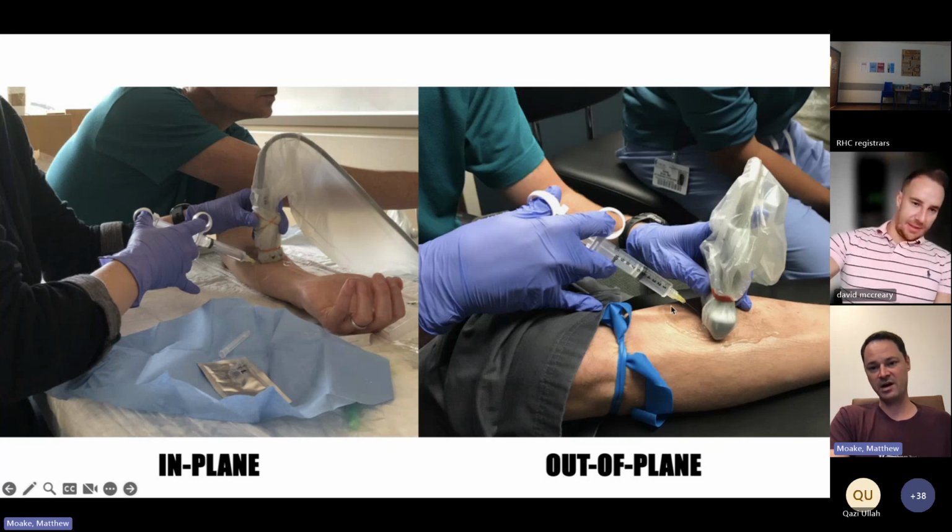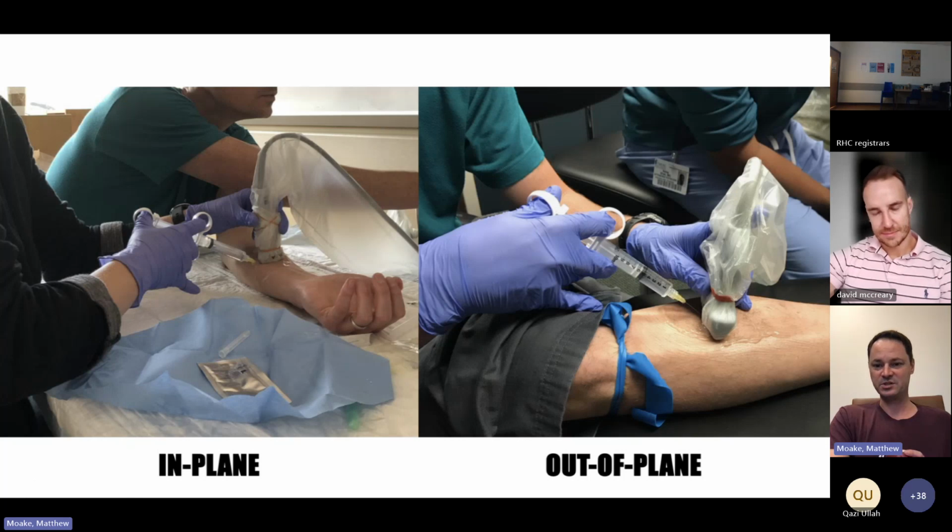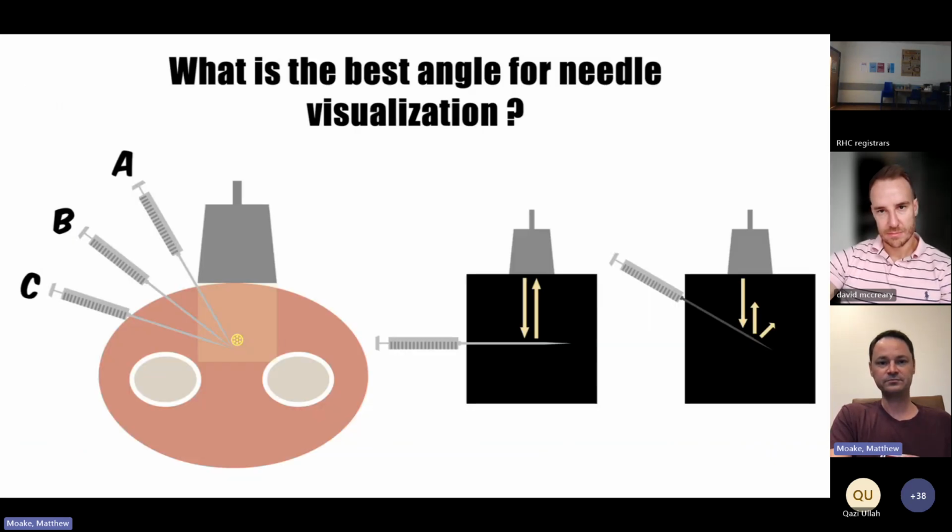This is actually me blocking my own saphenous nerve in conference one day. This is one where you don't really see the nerve well, and it's just going to localize right next to the vessel. So dumping a bunch of anesthetic right near the vessel basically takes out the nerve itself. But there's certainly roles for either one of these.